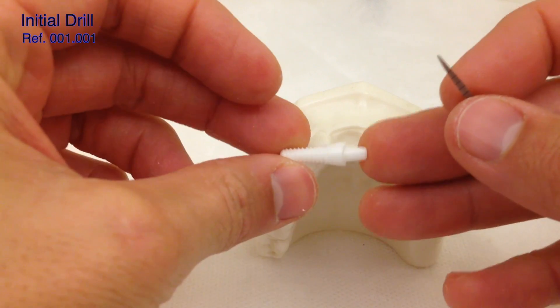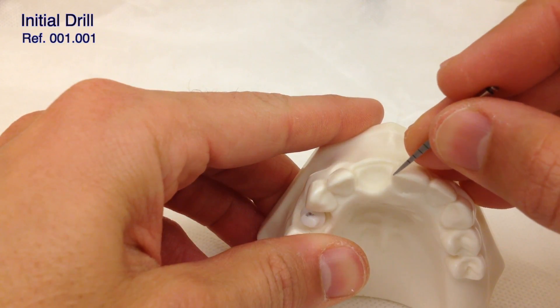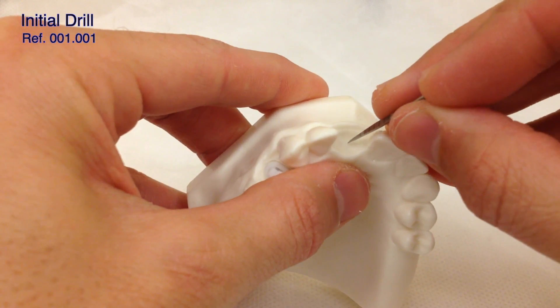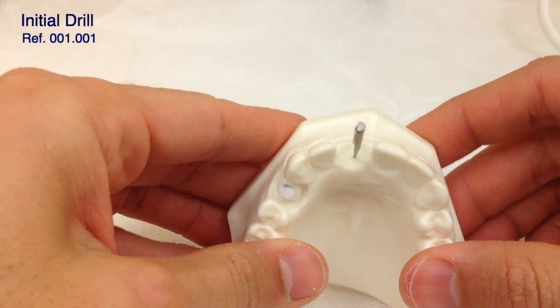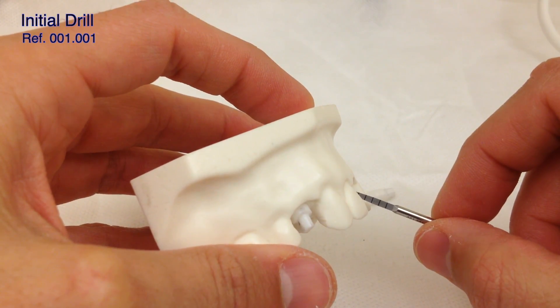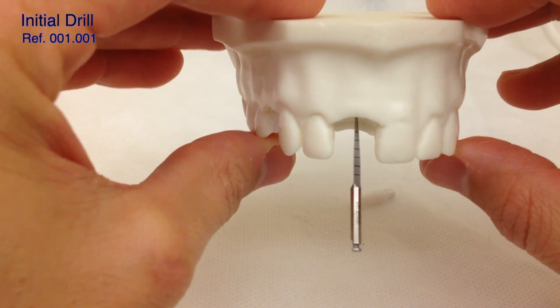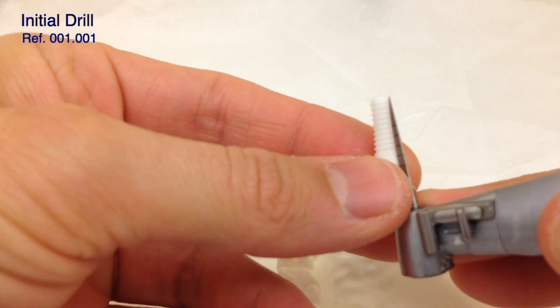We're going to start performing the drilling, and the drilling direction should follow an invisible line between the incisal edge corners — between the central and lateral. The drill has to come in the same direction. We'll do a test with the initial drill to show more or less the direction to follow. We have to control the mesiodistal position and also the buccal-lingual one. In the beginning it's more important to control the incisal edge direction — we don't want the implant too much protruded or too much toward the palate.